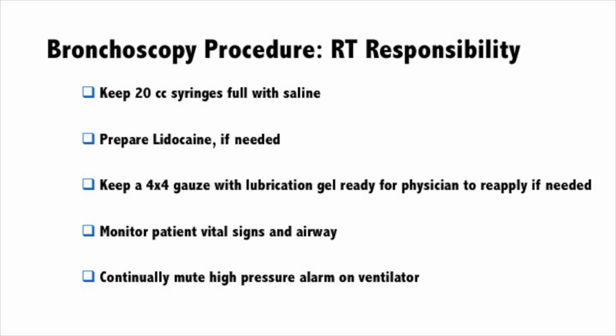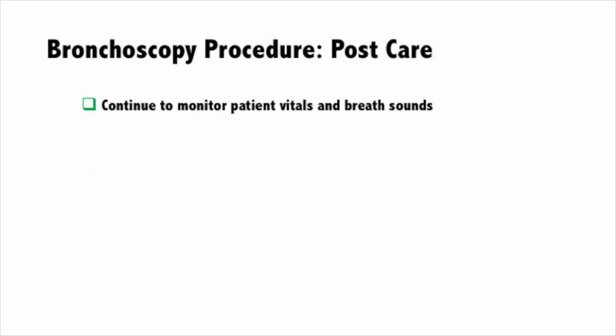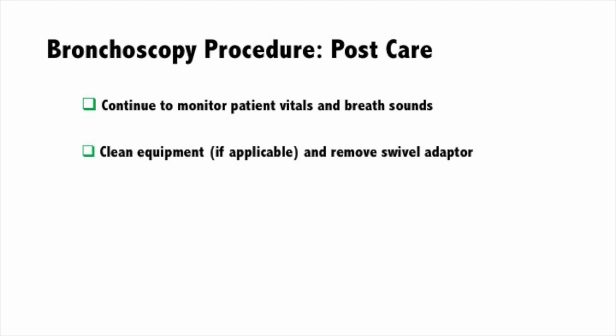You will continually mute the high pressure alarm on the ventilator and assist the physician in any way needed. After the procedure, you will continue to monitor the patient's vital signs and breath sounds and note any changes which might indicate complications such as pneumothorax. You're going to clean the equipment if applicable and remove the swivel adapter. Most importantly, you must remember to wean the FiO2 back to the previous setting.